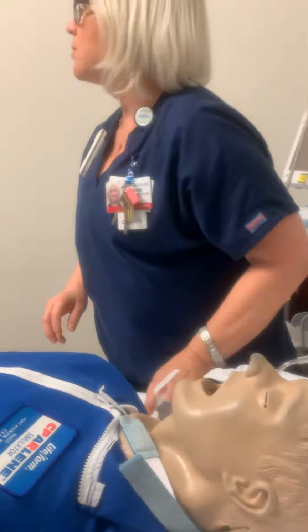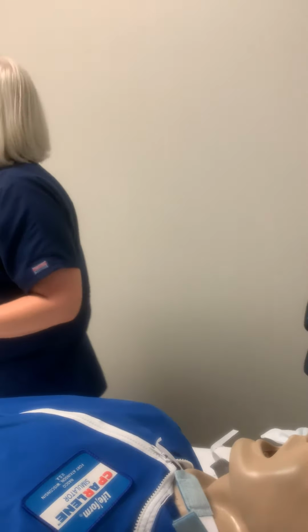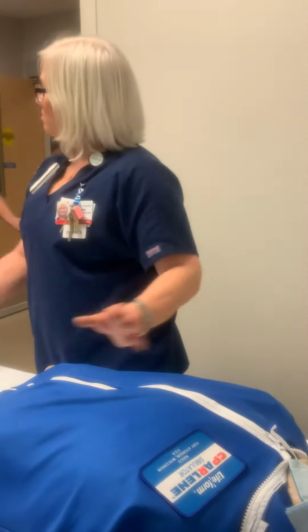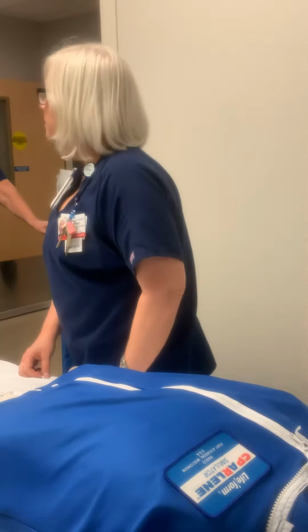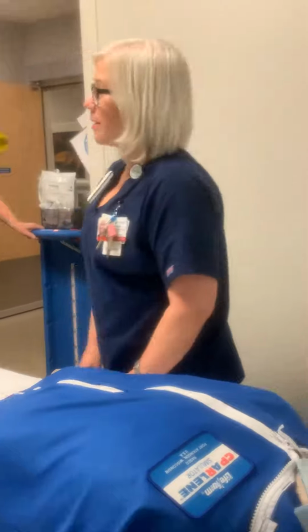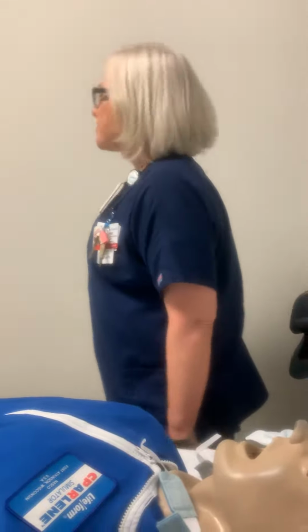So if my tube were to fall out, and I've got a laryngectomy, where am I gonna ventilate? I've got a laryngectomy with a temporary trach in, but my trach fell out. You're recovering them, and your trach falls out. What are you gonna do? But they're a laryngectomy. Don't you have to ventilate the stoma then? Absolutely. Would you ventilate up here? Is that an option? No, the air would come out the mouth.